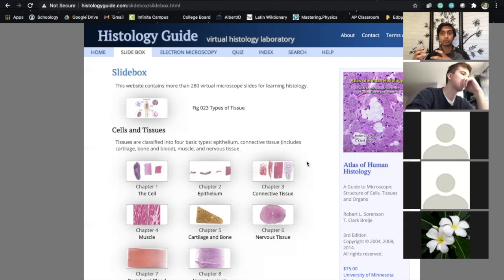In different organs, you have a different tissue makeup in the sense that the cells are different, they operate differently, but the fundamental understanding of what a cell is still applies. I'm sure you're familiar with this concept of cells making up everything. So when you take a biopsy, to understand pathology, what is wrong with a patient, one way you can do that with certain illnesses, and we'll see this today, is to look at the tissue under a microscope, where you can actually see the cells and see certain proteins, or at least representations of proteins based on dyes.